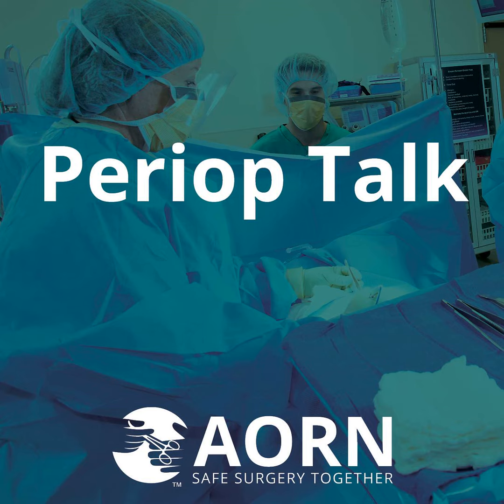So your team needs to look at those transport vehicles you're using. We have recommendations to check the cargo area. Is it cleanable? Can it withstand the disinfectants that you need to use to clean it? Is the environment controlled? Are we in a trunk? Are we in a van? Can we control the temperature, humidity? Can you separate clean and dirty items? That's really important, to have enough room to do that and have carts and containers that can allow that separation.